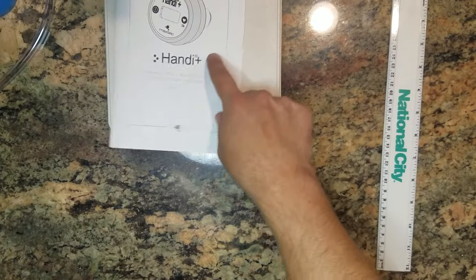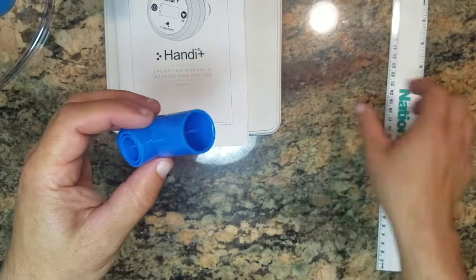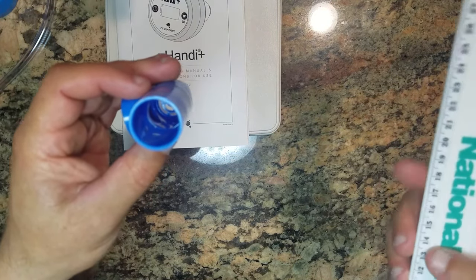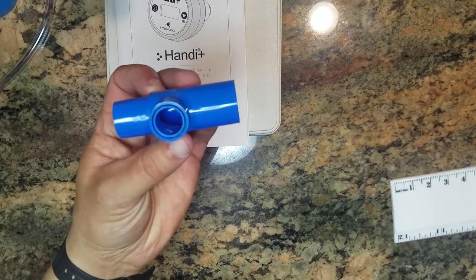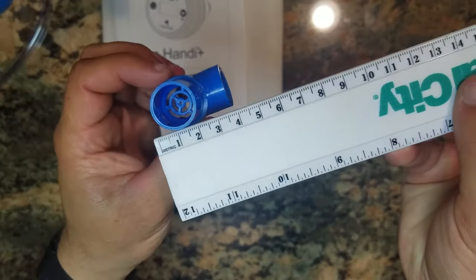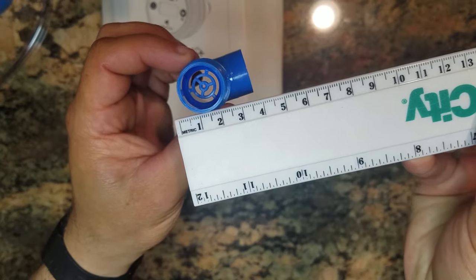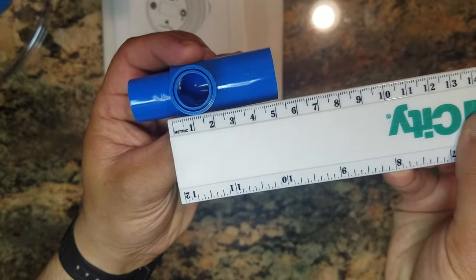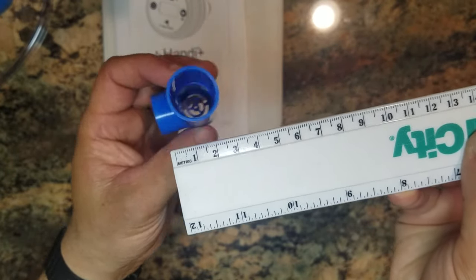We've also got this T-adapter. I'll give you the measurements on this — I'm pretty sure it's a standard size for medical equipment, but in case you want to see the measurements on these openings, you can freeze the video and that'll show you the sizes in millimeters.